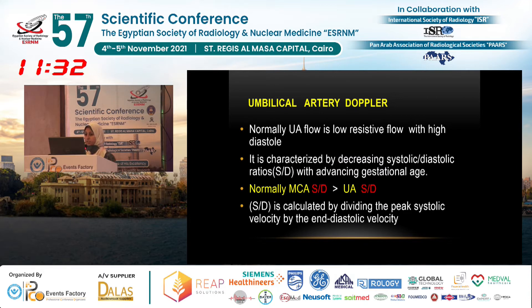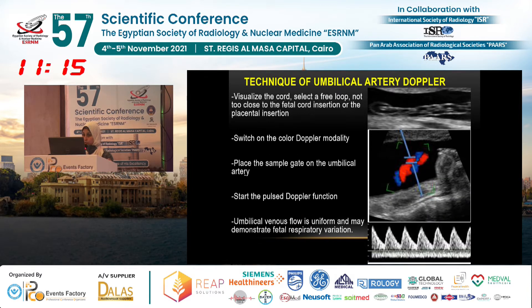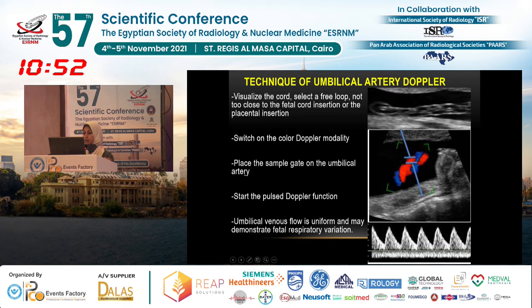Normal umbilical artery flow is a low-resistance flow with high diastolic flow, characterized by decreasing resistance with advancing gestational age. To measure the umbilical artery, we visualize the cord to detect a free loop not close to the fetal or placental insertion, then switch to color Doppler. This is the waveform obtained from the umbilical artery, and this is the waveform obtained from the vein. The umbilical artery is characterized by high diastolic flow, while the umbilical vein shows a flat waveform.